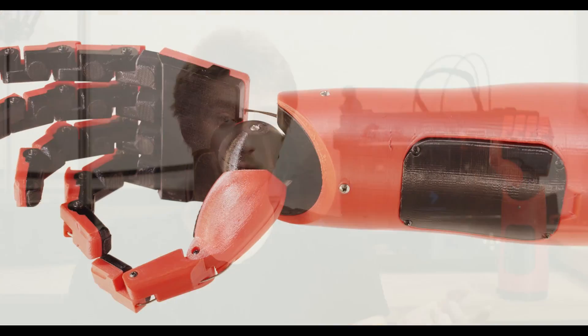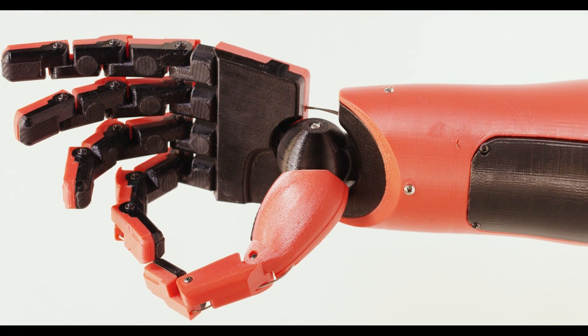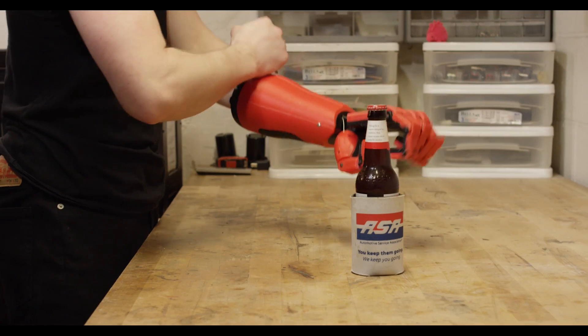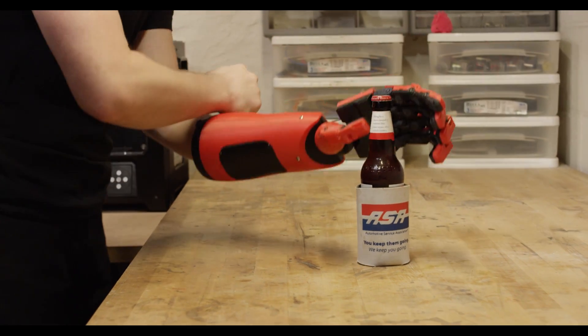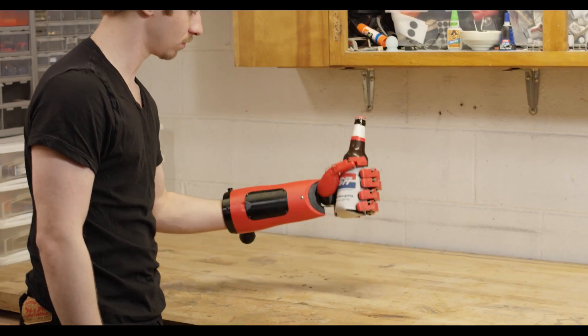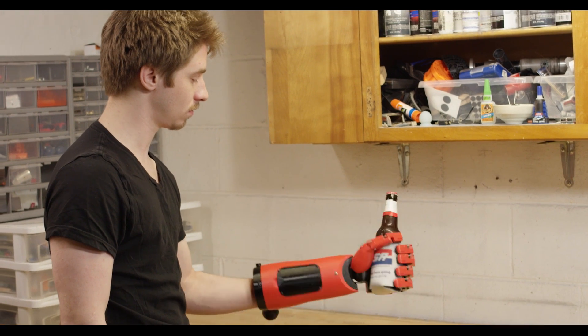Each finger joint also features a rubber grip pad to help it actually adhere to whatever object it is gripping a little bit easier, because it's one thing to actually tension on top of an object and something very different to keep it from sliding out of that tension based on just friction. To open the grip, simply pull the knob at the back, put the hand around whatever the desired object is, and then release so it auto-tightens around that object.